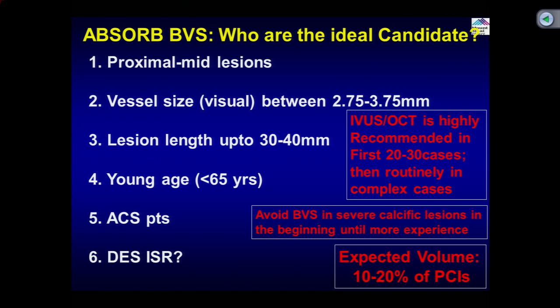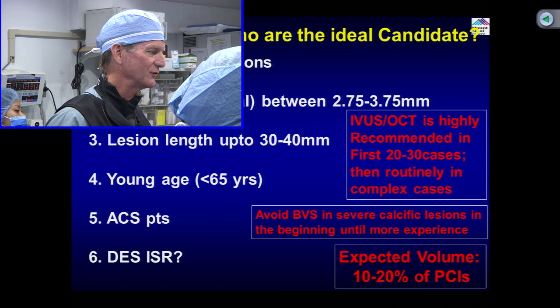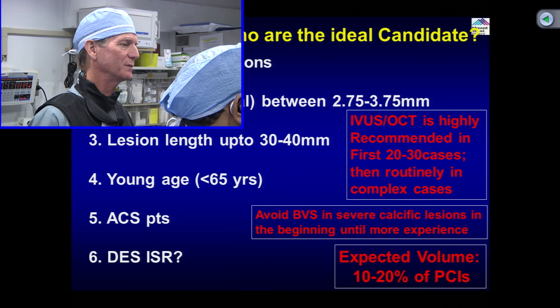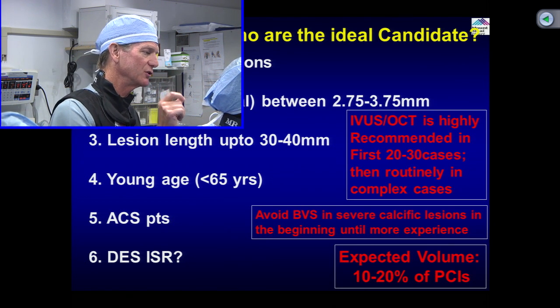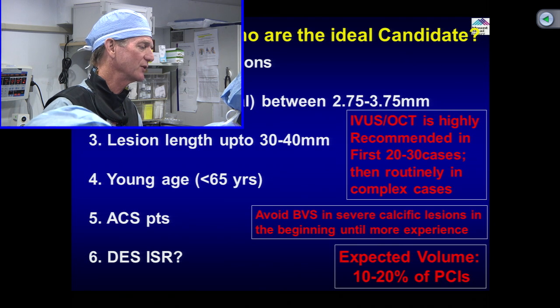No, at least theoretically it appeals. We've seen almost 200 patients in TROFI, yes, but for the STEMI subset this appears very appealing. Yes, I think so. Now, of course, it's off-label for all stents in the United States, but that's how you treat patients. Most of what you do is off-label, so we can't recommend it. Since I'm now working for the company and not independent like you guys, I can't officially recommend it, but I can tell you that a lot of cases are being done in STEMI. It seems to be ideal because the lesions are in younger patients in general, more proximal location, softer, and as you know, the Absorb scaffold struts are twice as wide as a Xience strut, so you get twice the surface area coverage, so you can potentially trap more thrombus and possibly reduce the risk of distal embolization.